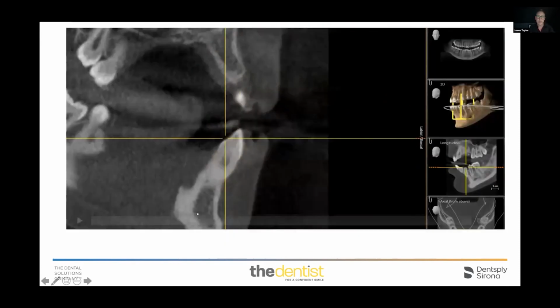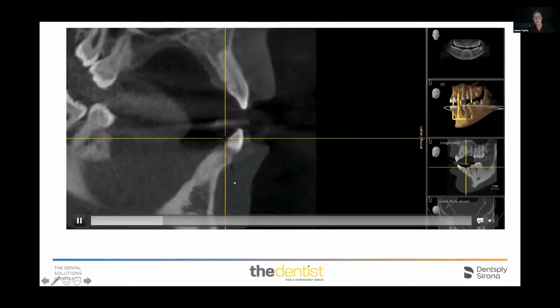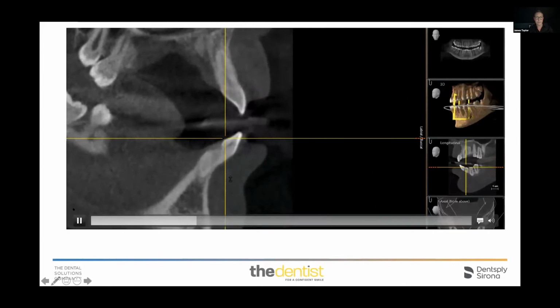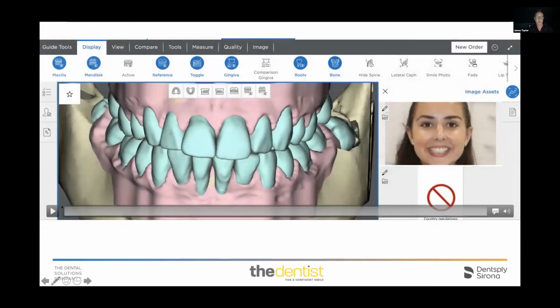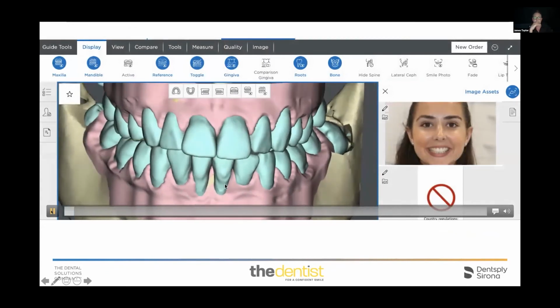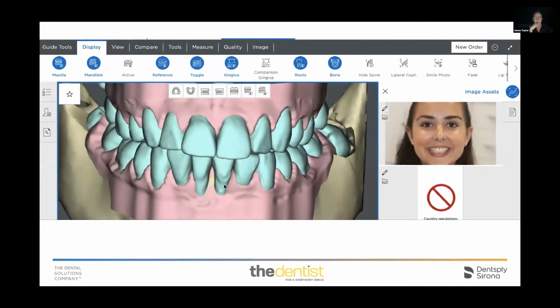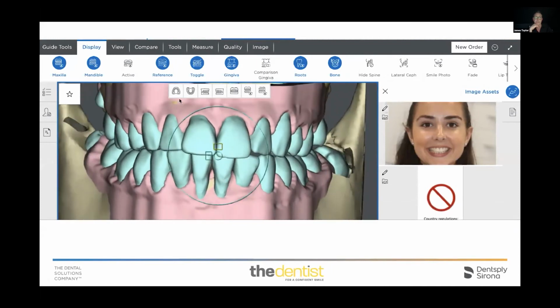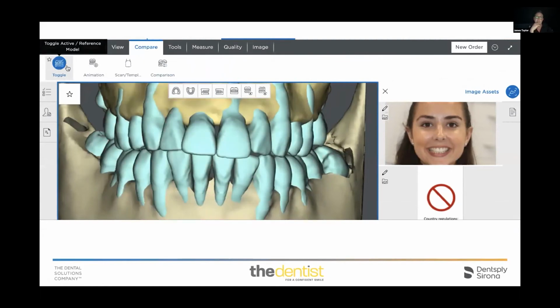So what are we going to do? Well, again, on the CBCT you can see there's no bone buccally. It's a very narrow ridge, but those teeth are just tipped too far forward. So this is before we started, and then the plan that we proposed and that we're actually in treatment on at the moment. And you can see how we're going to move those teeth back into the bone.